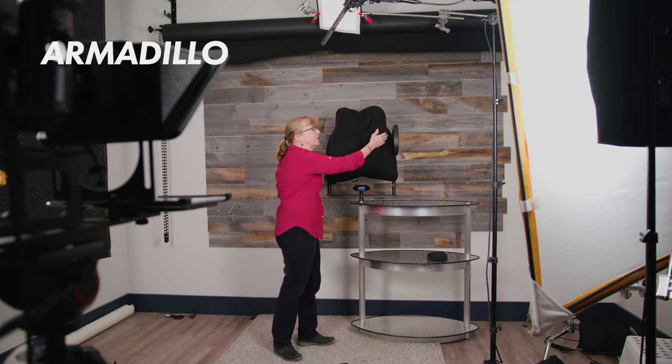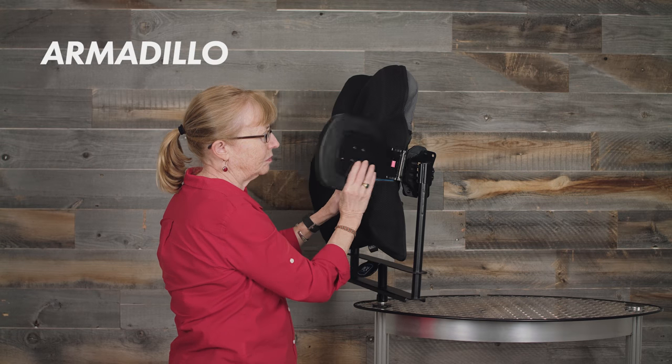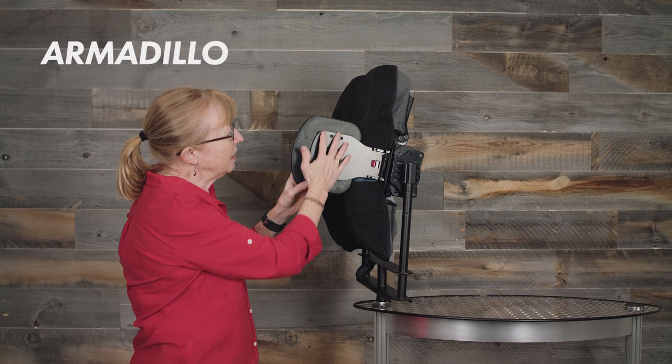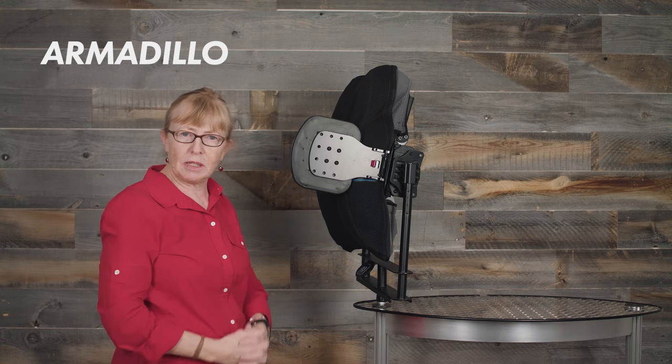All of our pads also can come with a neoprene cover for extra comfort for the client. We also have a fixed deep lateral with an extra large pad, and a swing away lateral with an extra large pad. Here's the swing away — that allows you to move it for a transfer, etc. The pad itself being extra large, you do have the flexibility of moving it up and down.